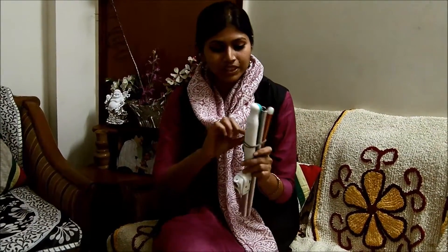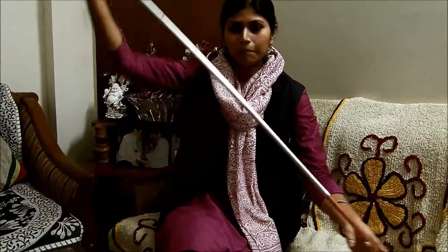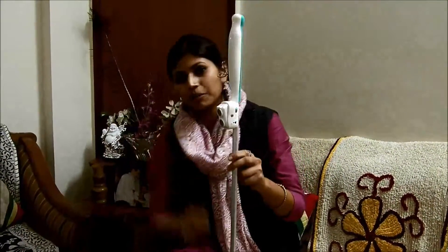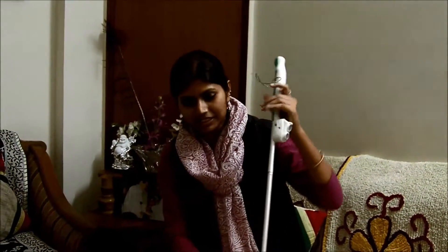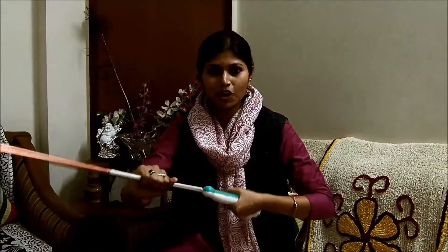So now let's quickly learn about the basic features and the application of this device. This device normally fits over a regular white cane and it enables a visually impaired person to detect obstacles from a safe distance of about 3 meters, and helps them to avoid objects, walk collision-free and navigate without coming in contact with people or objects.